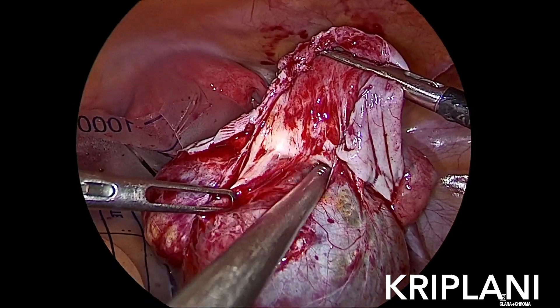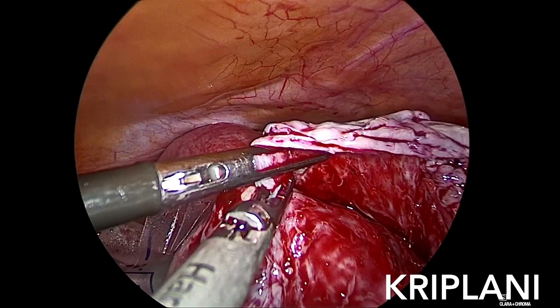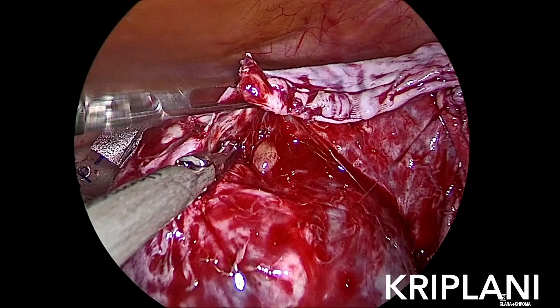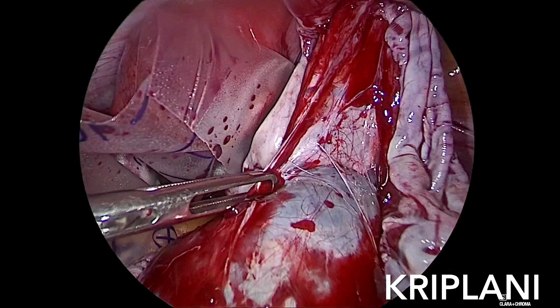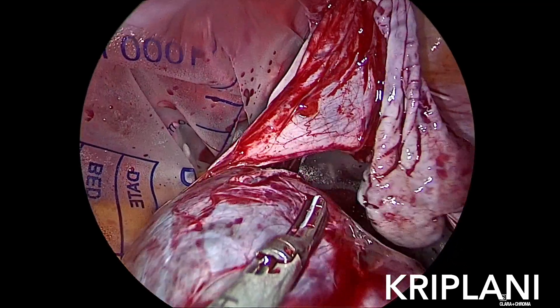One can see all these dermoids being dissected in the correct layer, and then with the help of traction and counter-traction, taking care not to remove any normal ovarian tissue, these are removed intact.